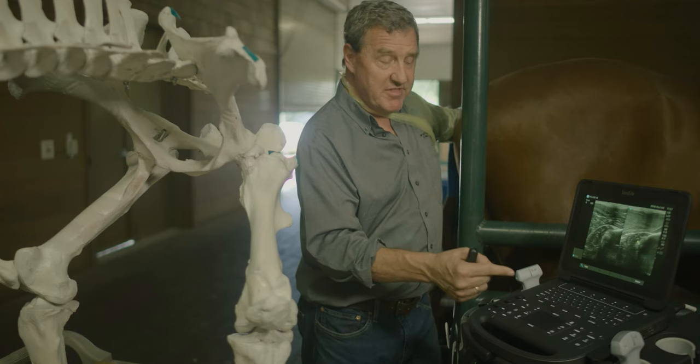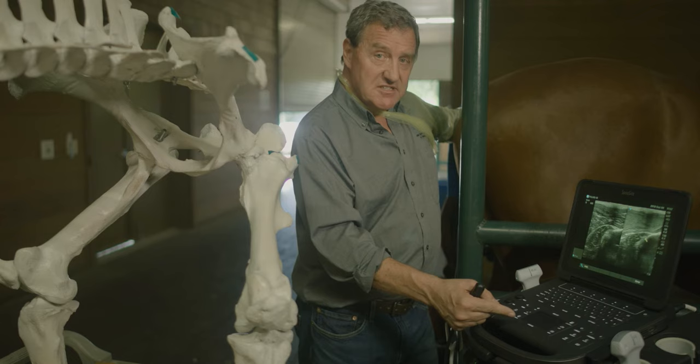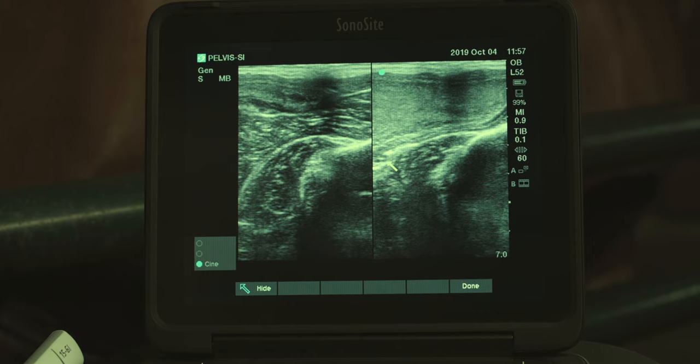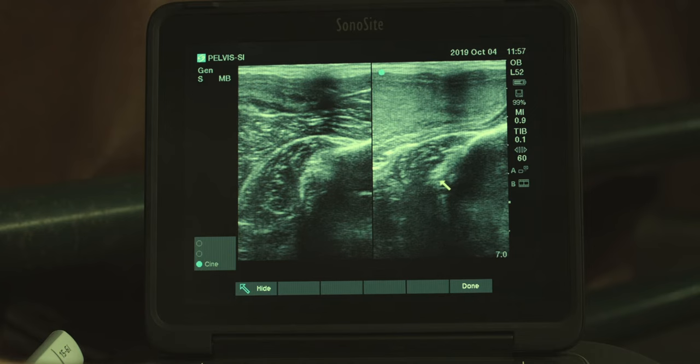It's very important to do that, and these muscle attachments are part of the whole exam. I've had injuries to these and you don't want to miss them. The only way to make sure you see them if there's a problem is to look each time. You can sweep through this entire examination very quickly. The rectus abdominis is on each side, and this little white attachment inside is the pectineus muscle. These are the entheses or attachment points for the pectineus muscles. That completes the pelvic floor examination and we're going to move to the pelvic roof.